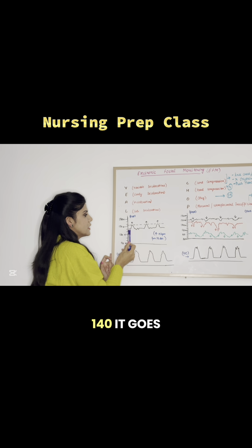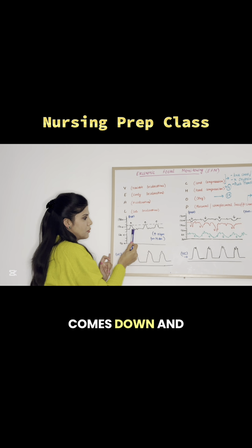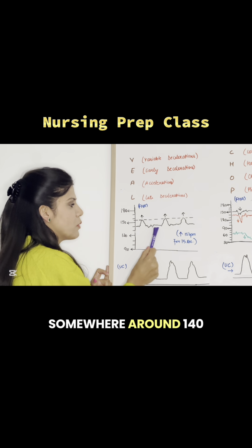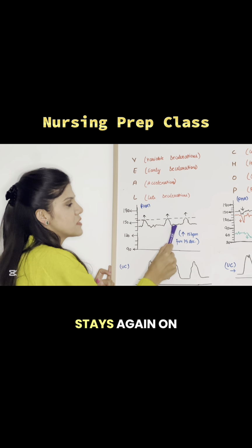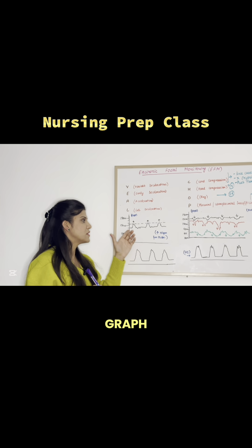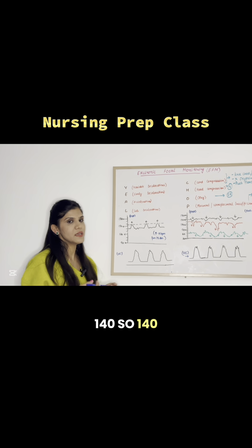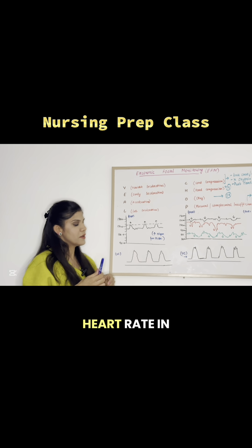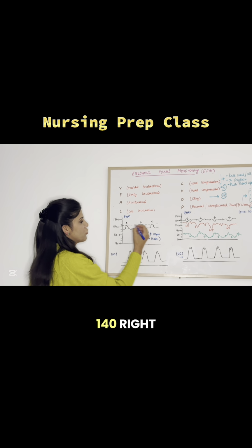It goes up, then comes down and stays around 140, and then again goes up and stays on 140. For most of the time the graph stayed on 140, so 140 is our baseline heart rate.